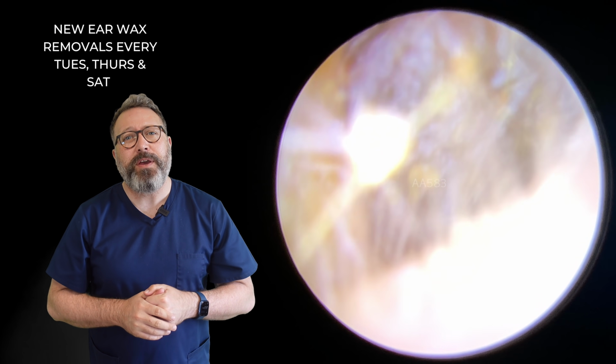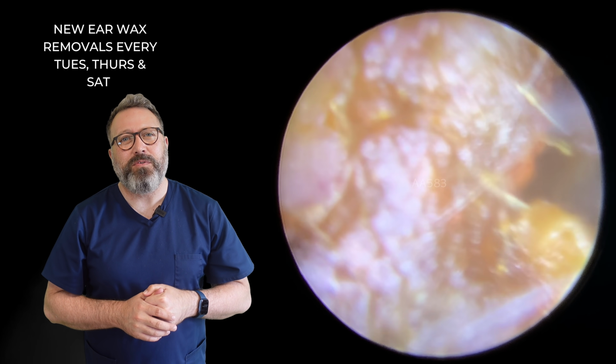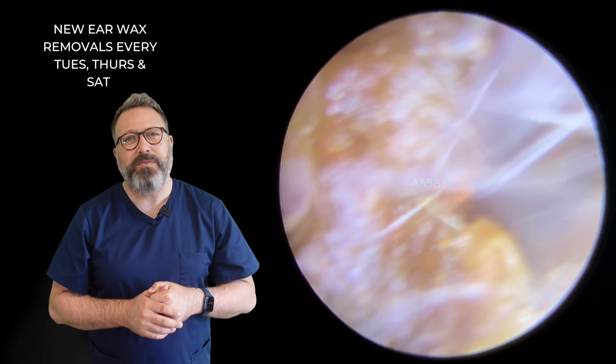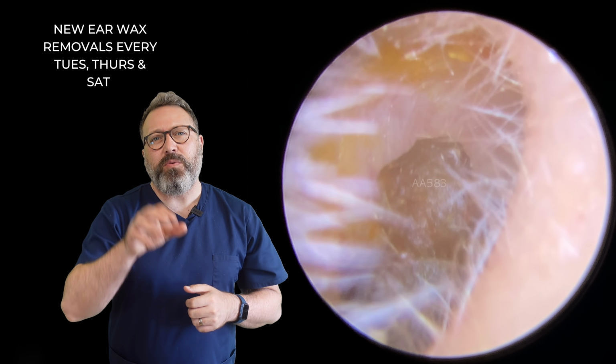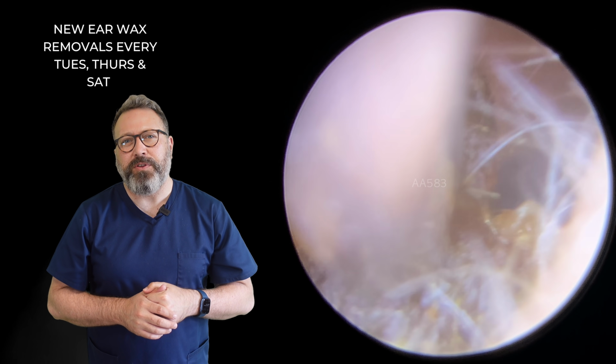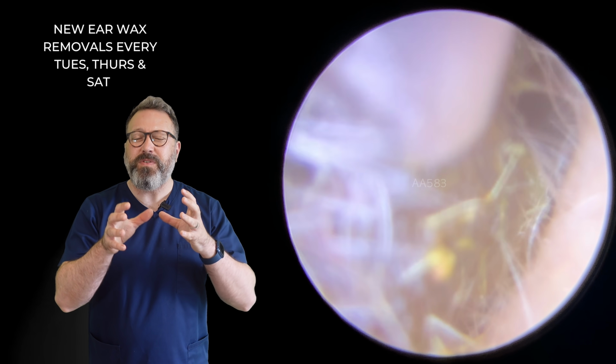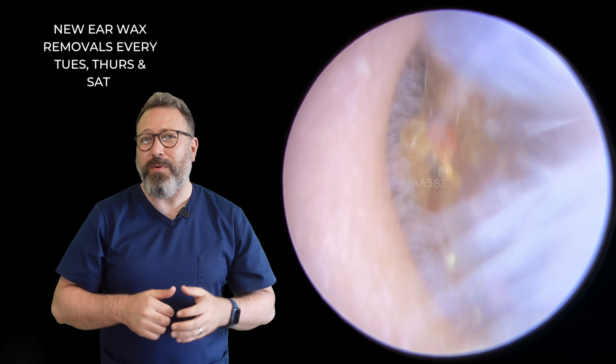So this is the second patient in the compilation. You can see quite a bit of wax in here, a little gap down the one side there. We just about see the eardrum through the gap. So we're going to go in now and see if we can remove this little section here. So let's get the suction tube on this. Now the first thing I always try and do is just get a little bit of a grip on with the suction tube, see how well it moves, and this one came out really well.